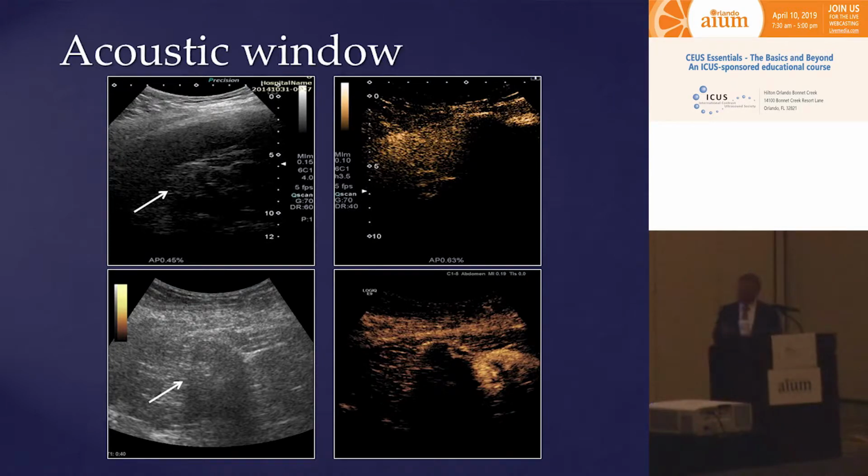Because most of the patients and most of the systems will probably have some kind of sweet spot between 10 to 15 centimeters. It will not scan beyond that using normal transducers. So closer to the skin the lesion is, better you're going to see it.